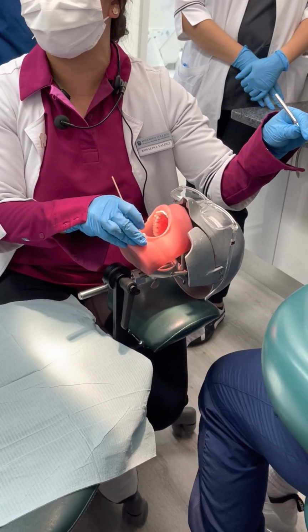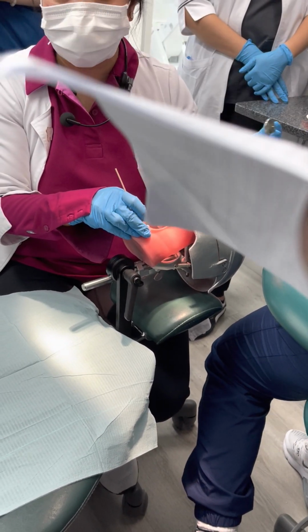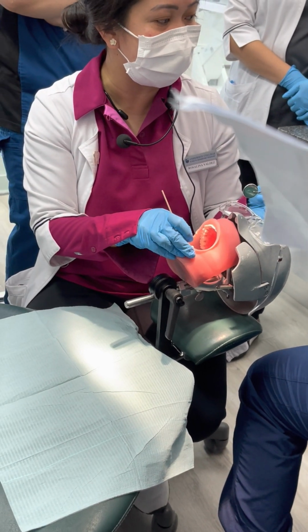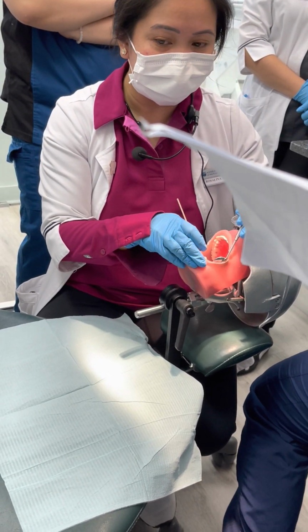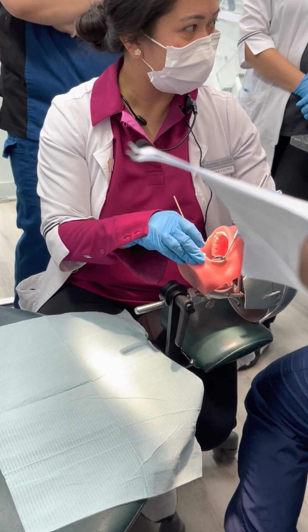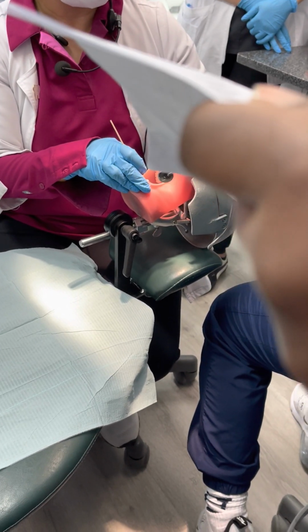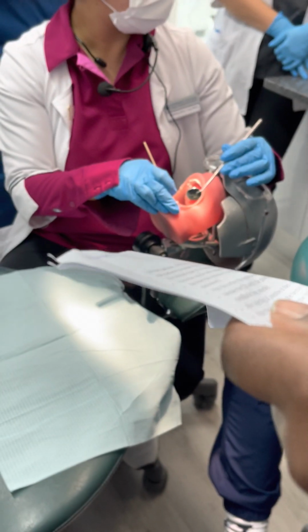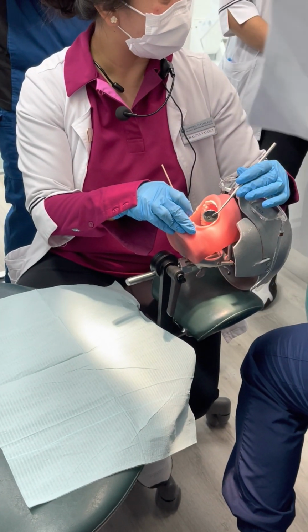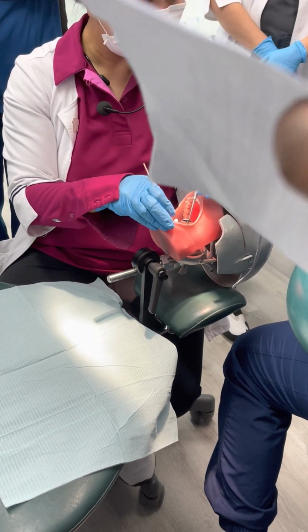We need it in every procedure. Right? You should know how to assemble the syringe still. I don't know if she remembers still. Oh, she does. I'm working on mandible. Make sure you get the right needle. Mandible. So where does this come in? Okay, that's okay, that's okay.